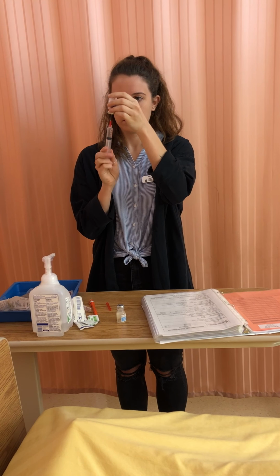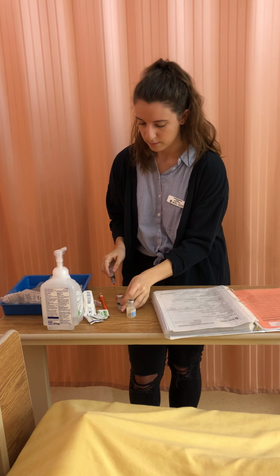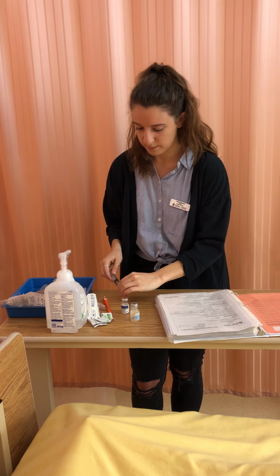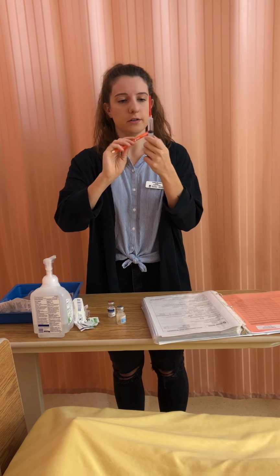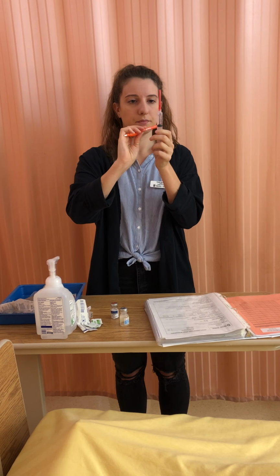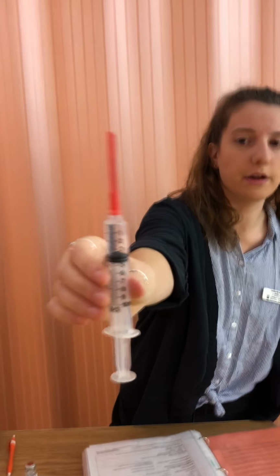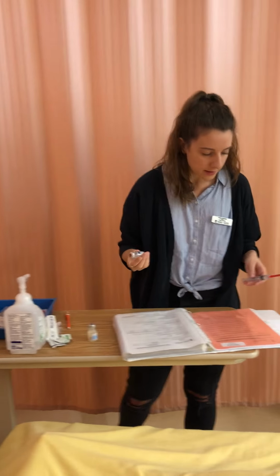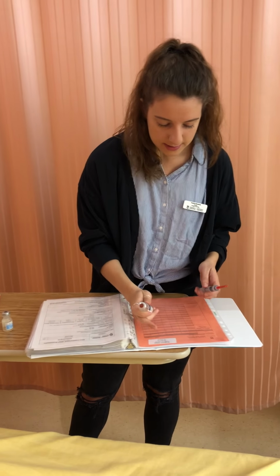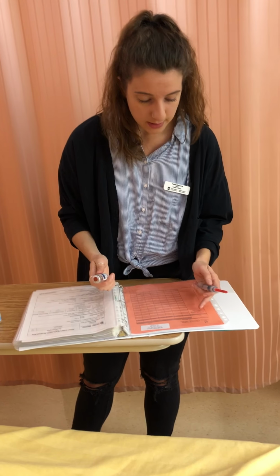Okay, so I have here that it is the correct patient which I've identified. Just gonna get the air out again to make sure of the correct dose. Correct drug, Zithromax, 400 milligrams, which I have in here. Okay, so there's 4 mLs in my syringe. I'm now gonna go and do my second check with my vial. So my right patient is Emma Wrightson. Right patient, right drug is Zithromax.